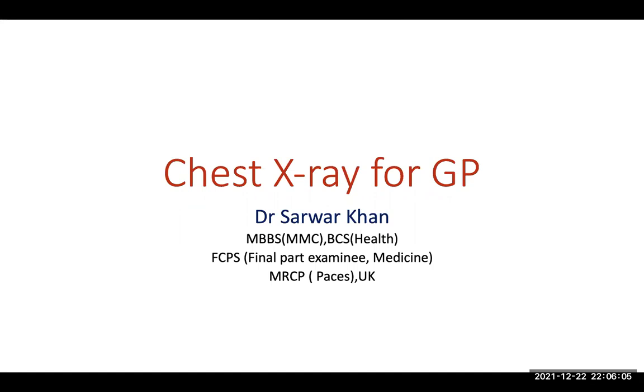Okay, thank you. So today we will talk about chest X-ray for GP. Actually, in this session, I will talk from the perspective of a GP, that means a general practitioner or family medicine physician. So we know that chest X-ray is a very important part of our clinical practice, and as a GP, you have to have a very sound knowledge about the chest X-ray.